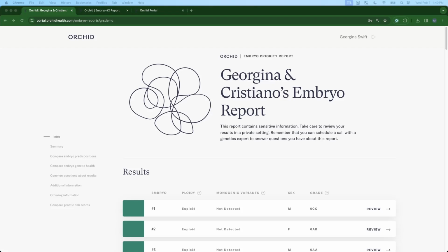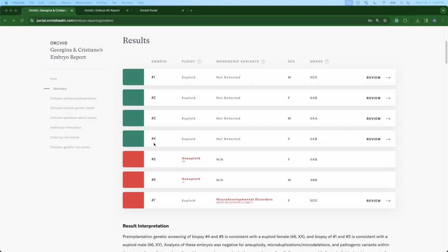Orchid's embryo screening comes with free post-test genetic counseling as well as access to an online portal. In this short video, I'll demonstrate how to use your online portal to review the results specifically related to genetic predisposition screening. On the main page, you'll find a summary of the name of each of the embryos as well as the results of the other analyses.